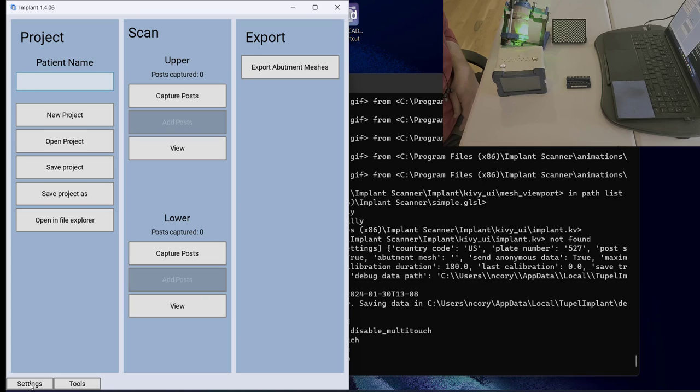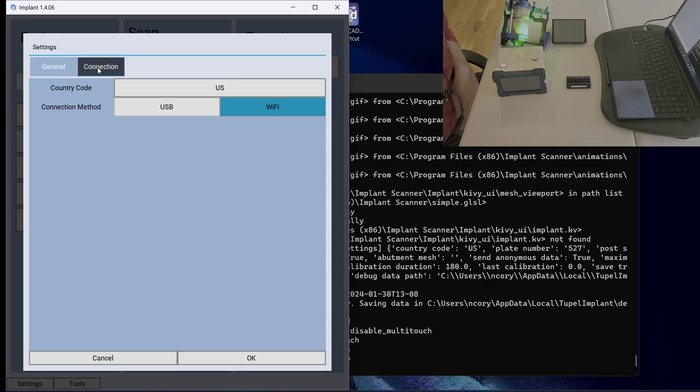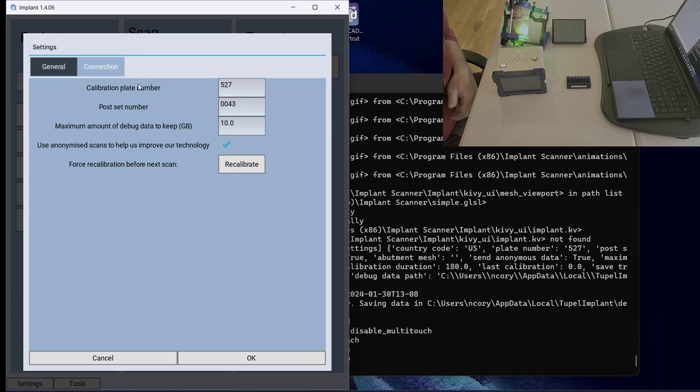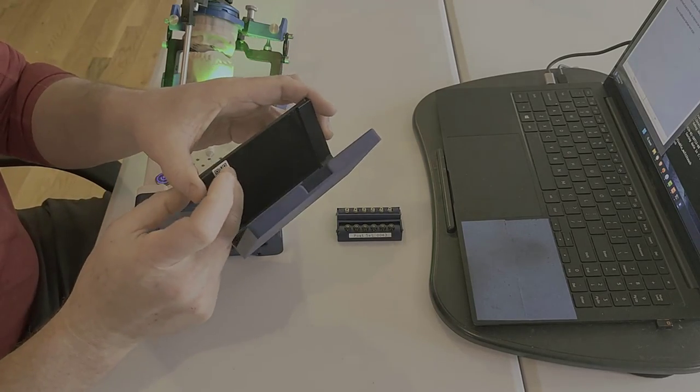Just to show you a couple of things, if you go to settings, you've got your options for connection, and so make sure you put in the right country code. You can connect with a USB cord if you would like to do that, but then you're tethered to the computer, so I would much prefer to do Wi-Fi. If you go back into general, you can see here there's a particular number on the calibration plate which you'll have to enter. You see it right back here.